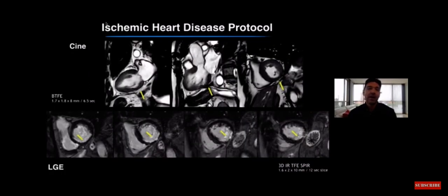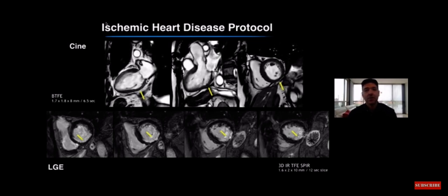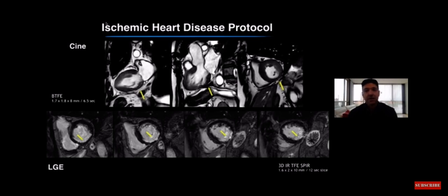So finally, another daily MRI study request are patients complaining of acute or chronic chest pain. In this example, cine sequences show us an inferior myocardial motion abnormality with moderate LV dysfunction, and we could say that evidently something bad has happened to this muscle. And the LGE images revealed in white a subendocardial infarction. So in this case, we arrived late because scar is already there, but maybe more myocardial tissue is in danger and needs to be saved.